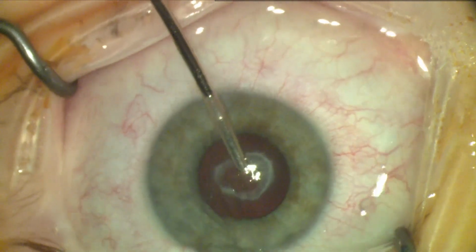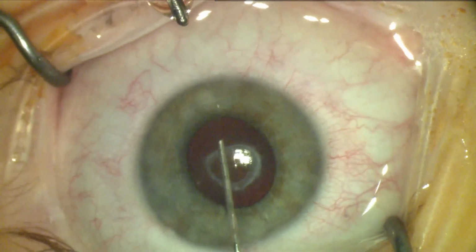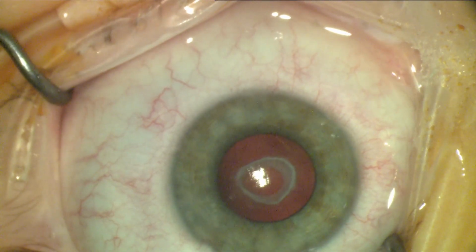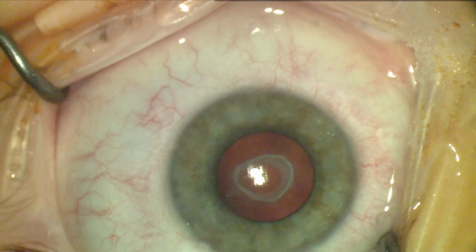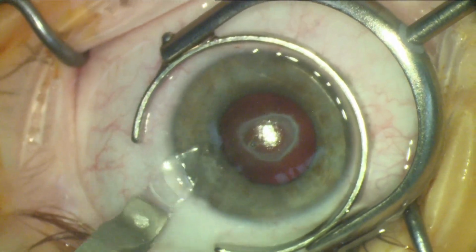After most or all of the material is removed, you can see that the capsule is much more clear and the view is far better. There is also far more room to place a lens. In this case, I placed a 3-piece lens in the sulcus space and felt this was very stable and well centered.